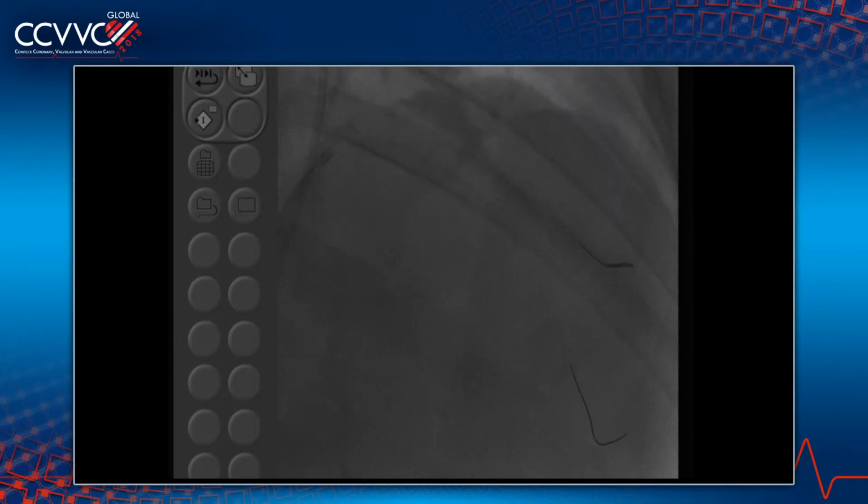We heard so much debate on the DK crush, but that was mostly for the left main. What do you think, Ron, which way do you go? Do you do mini crush here too, TAP, or DK crush? I prefer mini crush here, personally. But I think that all of the above are okay. You can do culotte, you can do mini crush, and you can do TAP. With TAP, I think the issue is to get closer, not to miss a gap. You don't want to miss the gap of the ostium of the diagonal. Jeff?